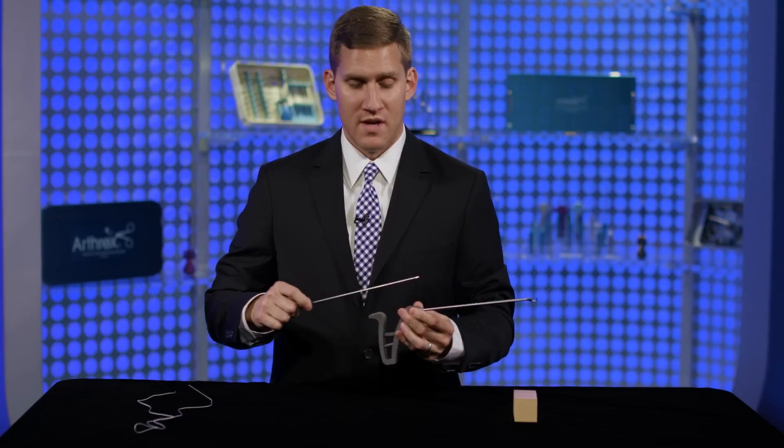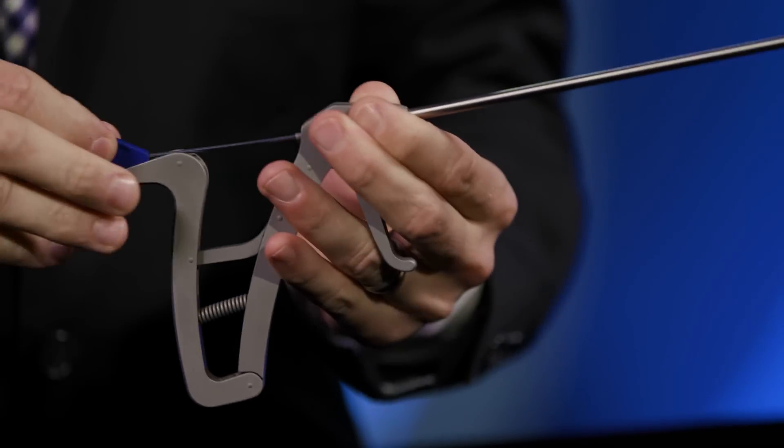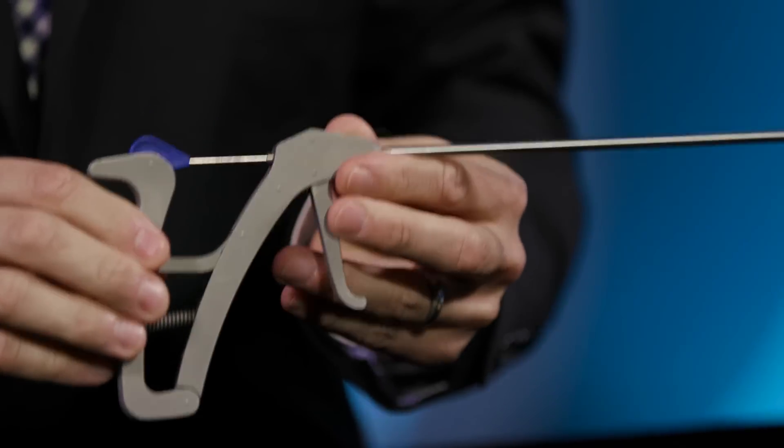The Capsule Closed Scorpion is a reusable handle with a disposable stainless steel needle component. The needle is disposed after each case to ensure its sharpness during the procedure. To load the needle through the handle, you'll simply feed it through the inner cannulation and lock it on the back barb of the device.